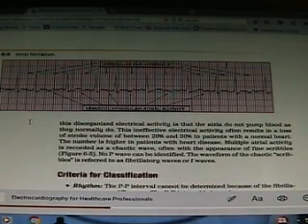You know your emergency traces. That means you do what? Stop the machine, inform your chain of command immediately. This person will be symptomatic. This person will have some trouble breathing, will have chest pain. There's going to be a whole bunch of problems. Because remember, just because you're the technician, pay attention to your patient.